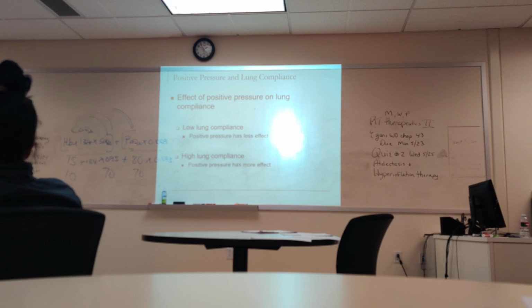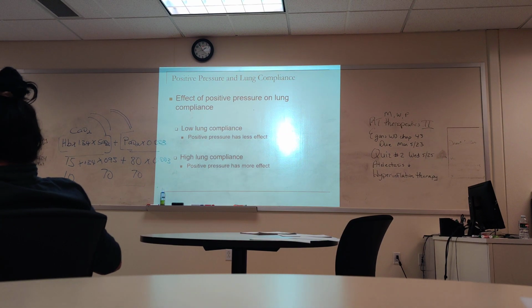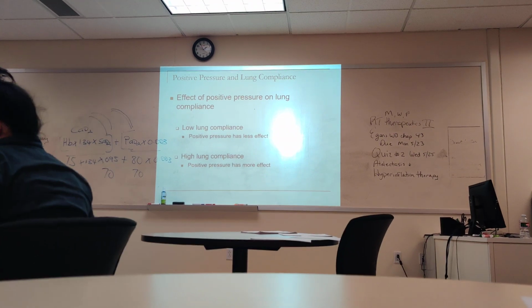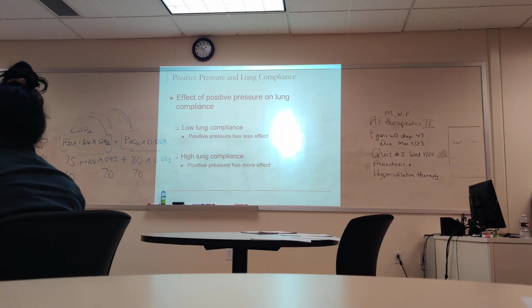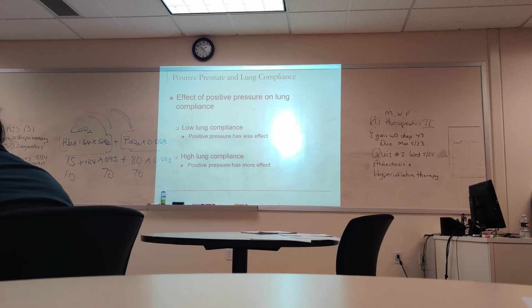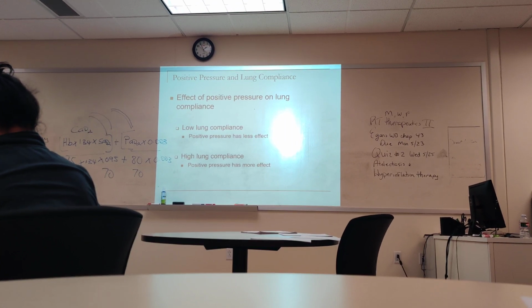Effect of positive pressure ventilation on lung compliance. Now, if you have very low lung compliance, meaning that your lungs are very stiff, you will not see a lot of side effects of positive pressure ventilation compared to if you have a very high compliance. So, the stiffer your lungs are, the less effect that you see on your hemodynamic values.